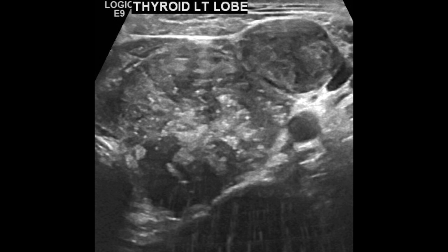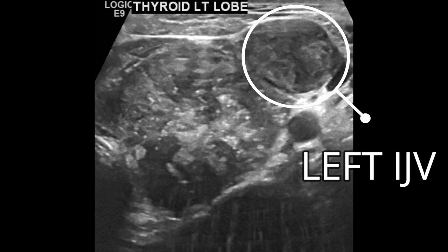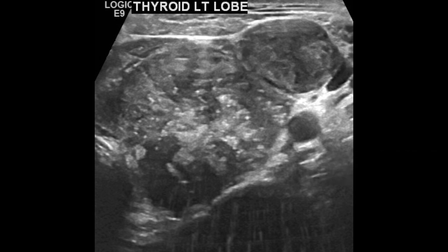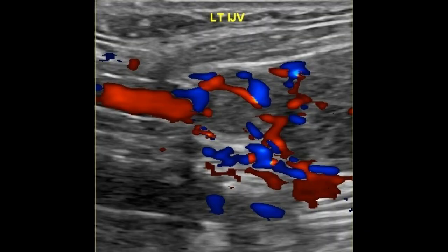If we look here, we can see that there is a thrombus within the left internal jugular vein. When we scan the left internal jugular vein with color Doppler, we can see that there is vascularity within the thrombus, meaning we are dealing with a tumor thrombus.